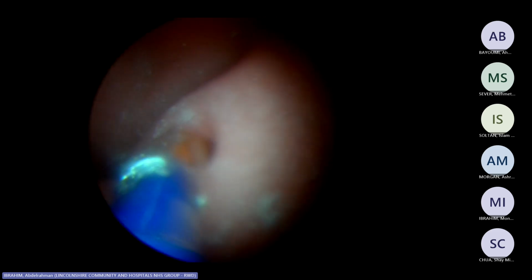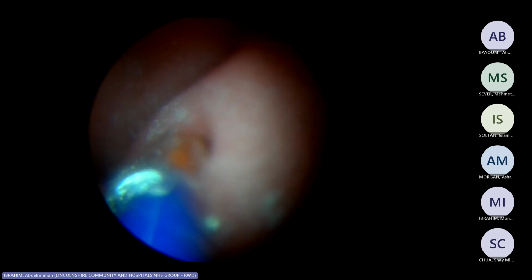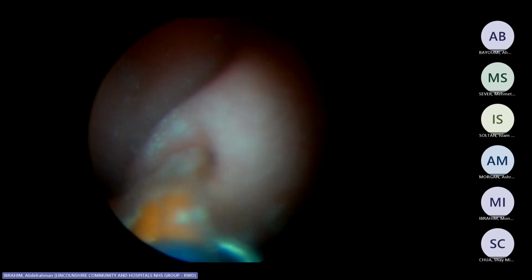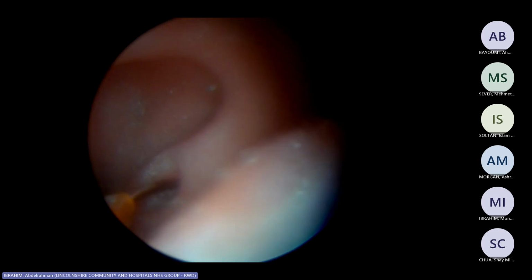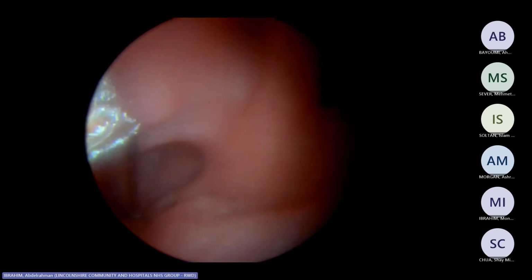Well, it's fine. We can do this when we are ready. This is the pushing, and this is the back. This is to advance the balloon and to get it out. So once the catheter and the lead are in, you just push the balloon in and then inflate. Once it's been deflated, just push it back, and then you pull it out, and again we'll shift this out and go out.